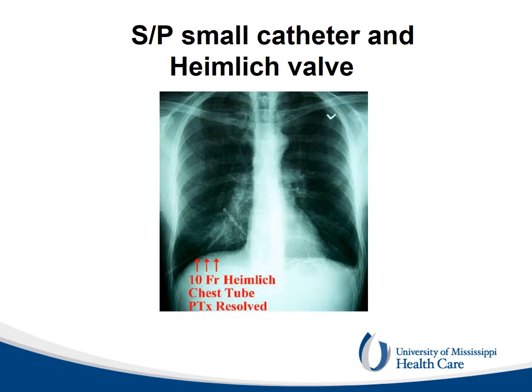The incidence of iatrogenic pneumothorax from CT-guided needle biopsy is more common when big needles are used and/or in patients with emphysema, as in this patient. The radiologic signs of emphysema are flattened diaphragms, increased intercostal spaces, and hyperinflation of the lungs, the so-called barrel chest.